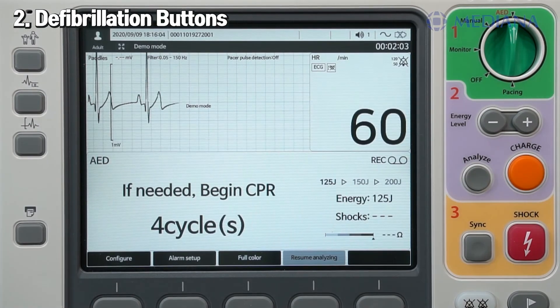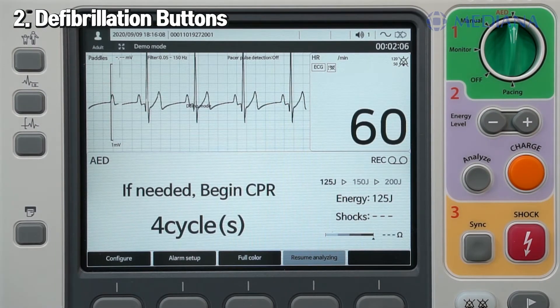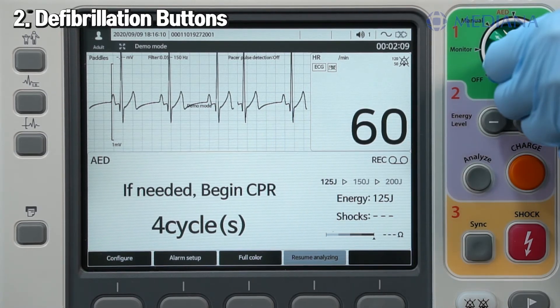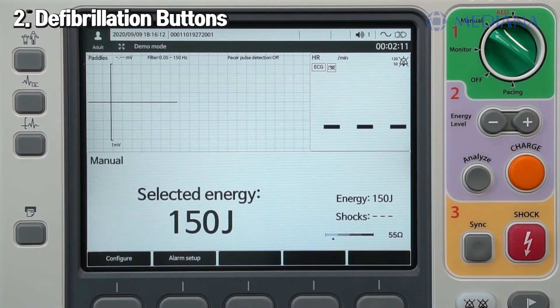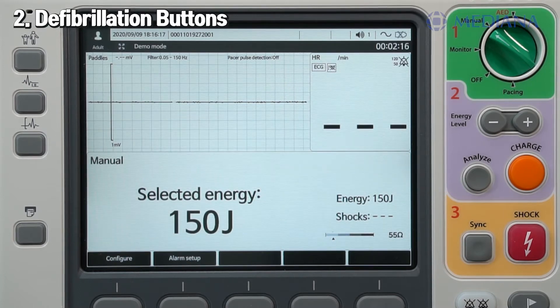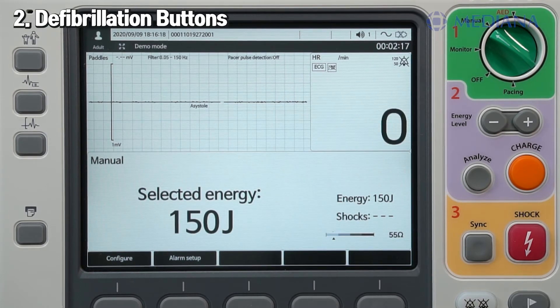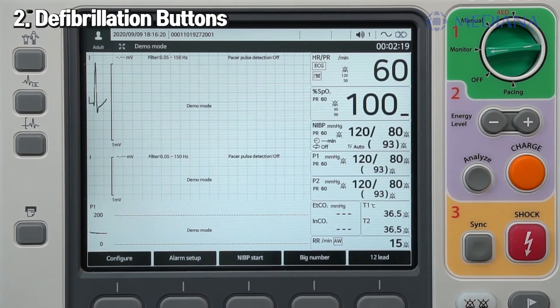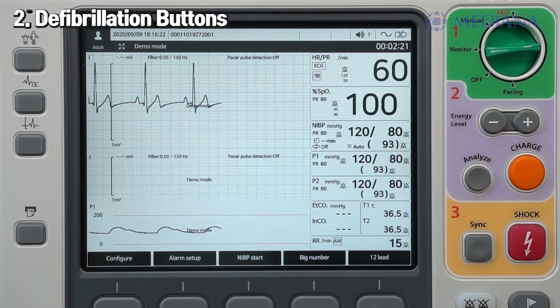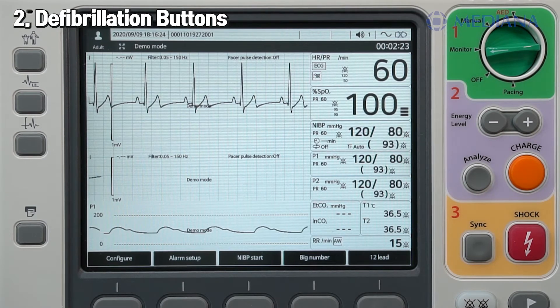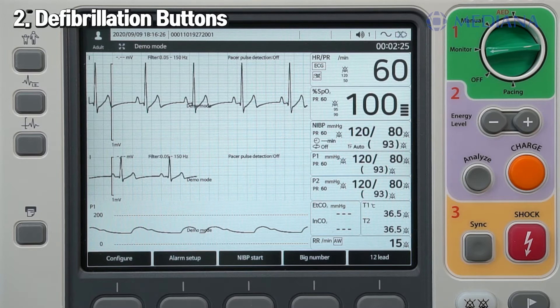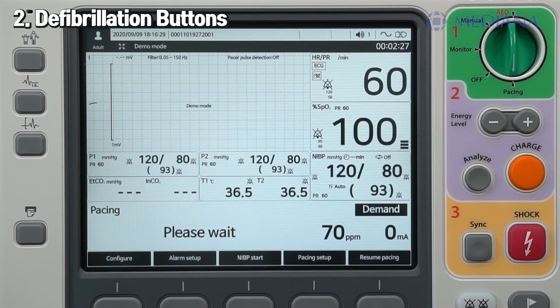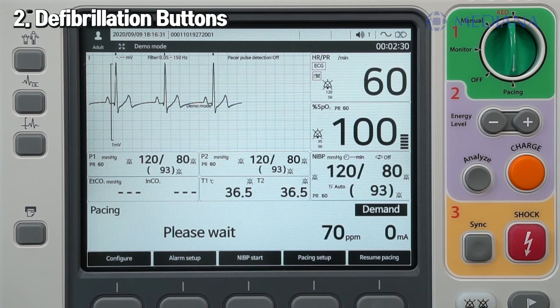The gray scale setting applies to every mode. Users may change the color filter setting. By default, the screen is set to color, but it can also be set to black and white mode. When the device is used outdoors, visibility may be reduced due to strong external light. Therefore, changing the display setting to gray scale mode switches the screen to black and white, which improves visibility and user convenience.